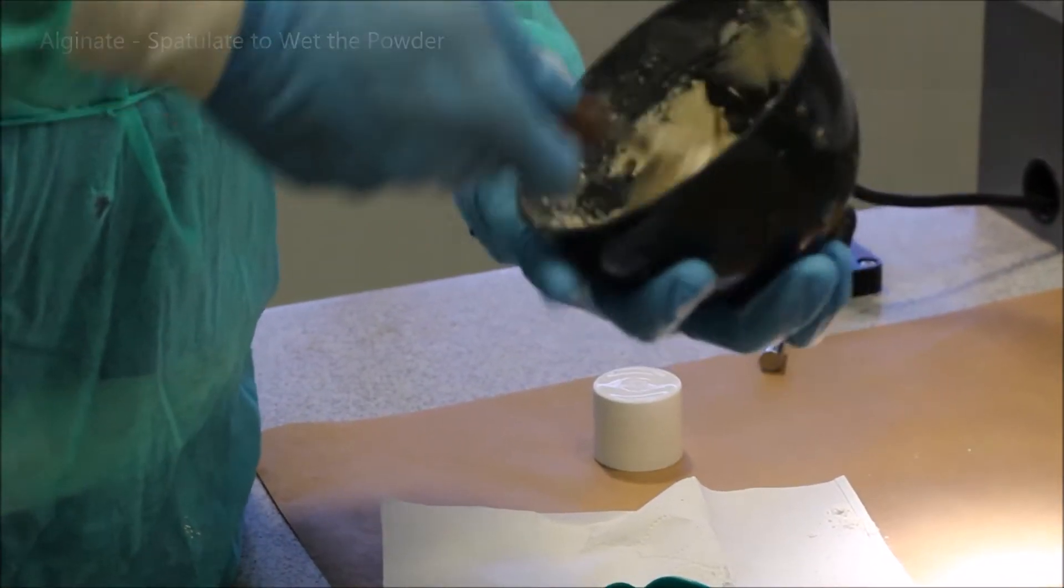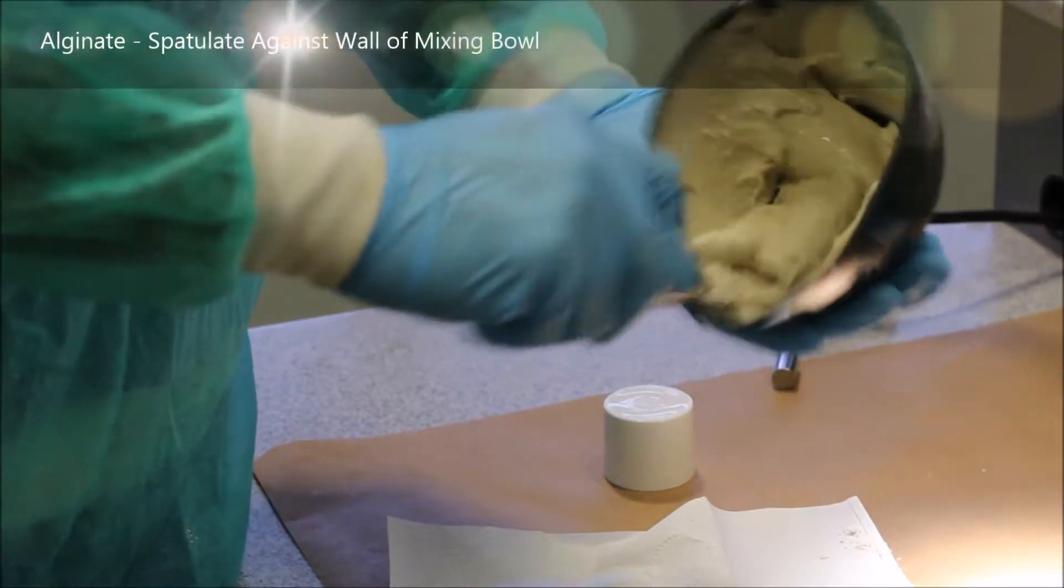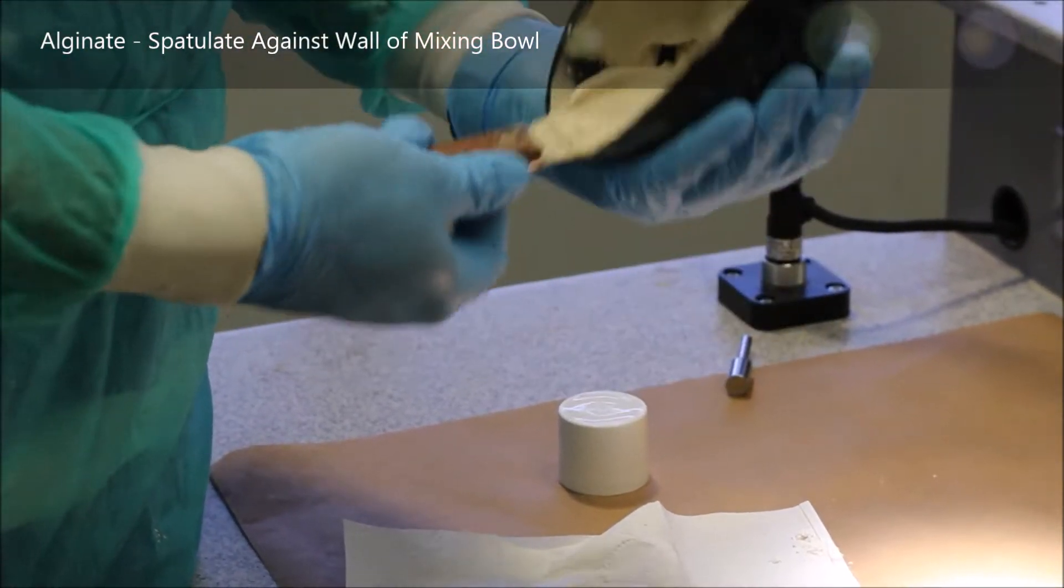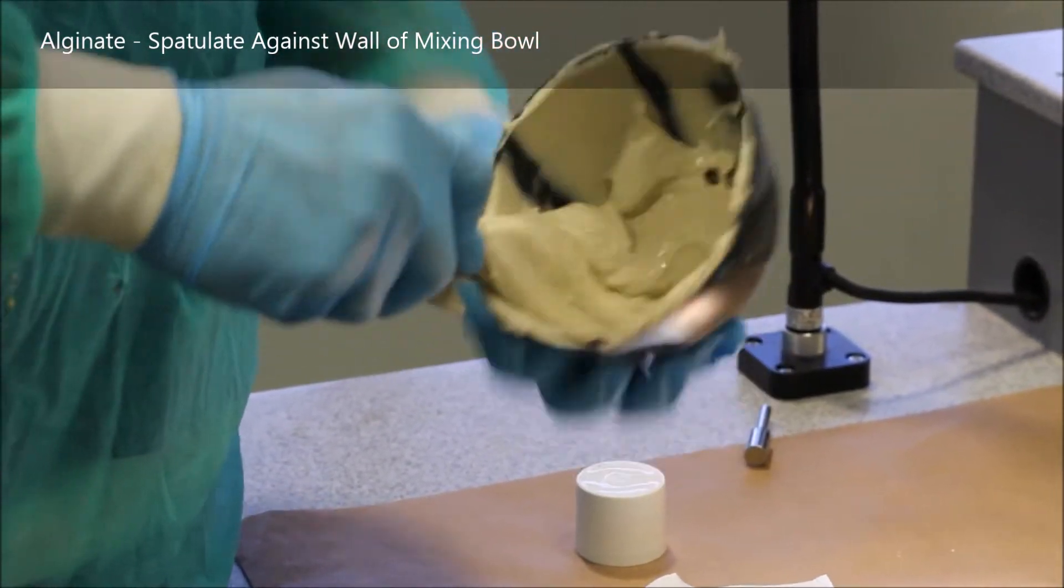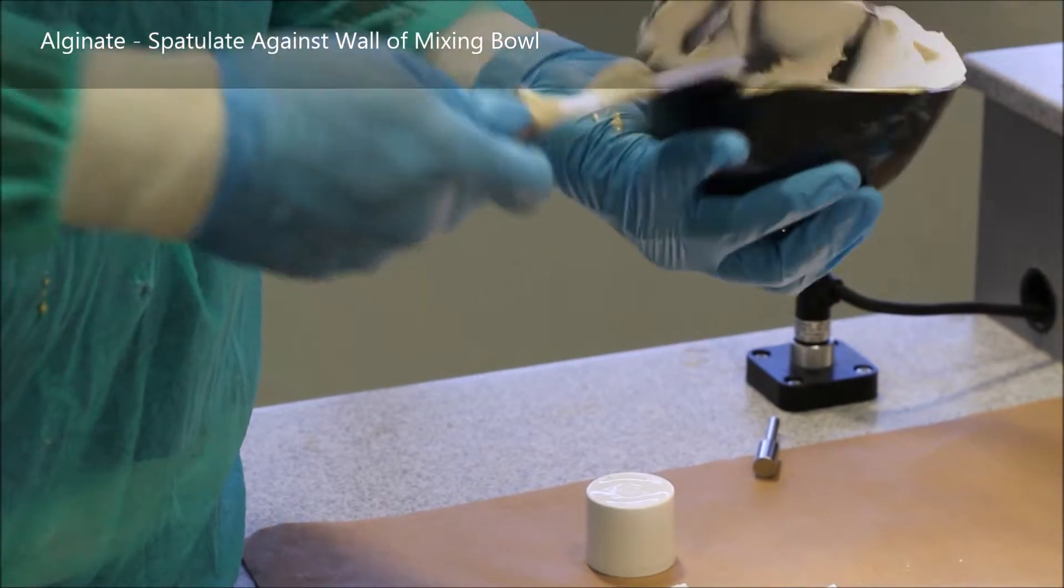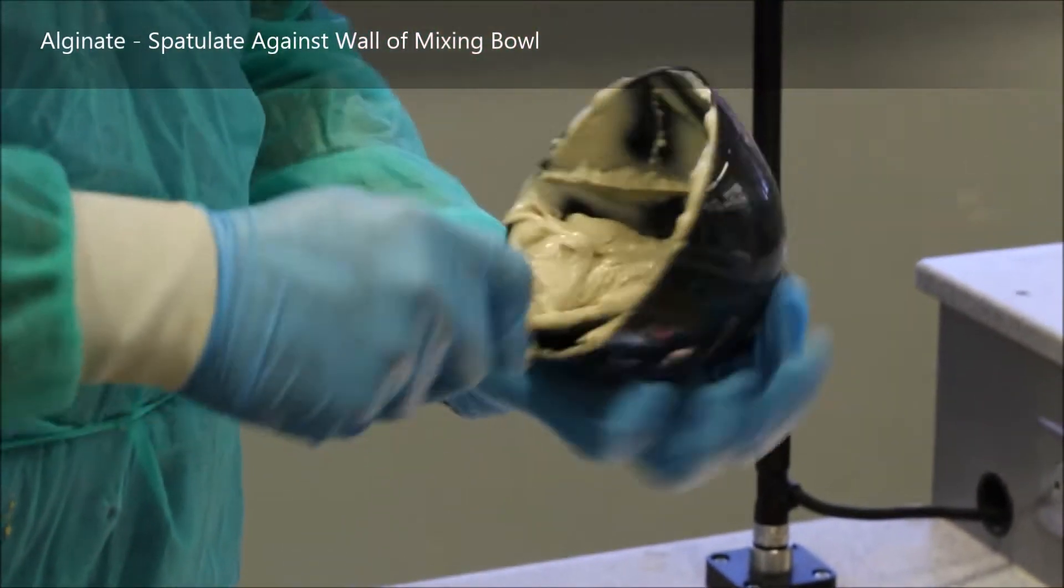As you finally feel that the powder is wet and it gets to a sort of doughy consistency, you can go ahead now and press it against the walls of the bowl. This will eliminate any bubbles from showing up in your impression.